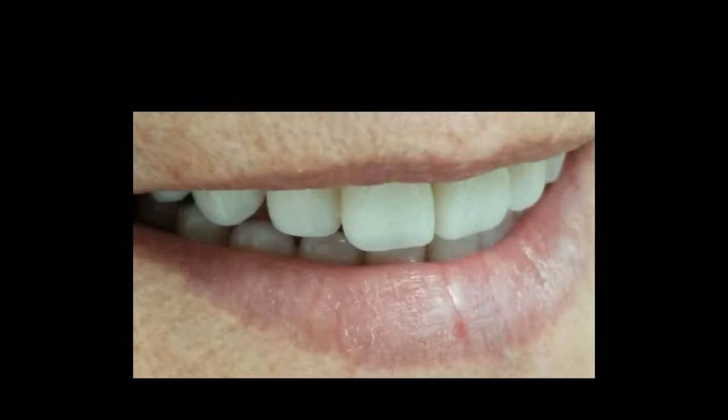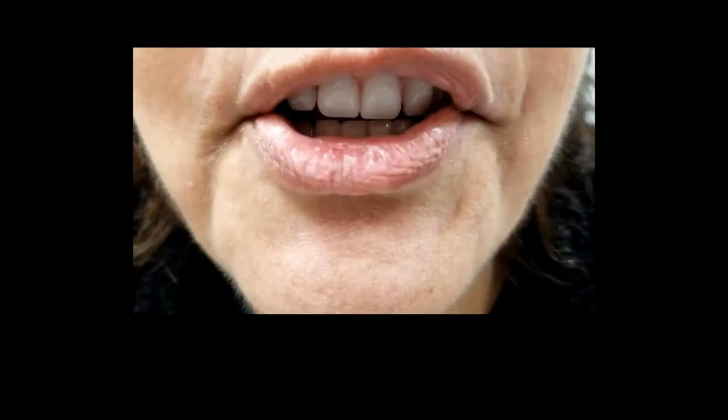So now what I'm trying to demonstrate to you is that the jaw moves. And when we check an articulator and do anterior contact and protrusive contacts, we're bringing the articulator straight out to check those contacts. I am now saying to you that that's not necessarily correct for that patient. It can come out, yes, but it also can drift to the side. And we can start to identify that by retraining our eye to watch for things when people speak.